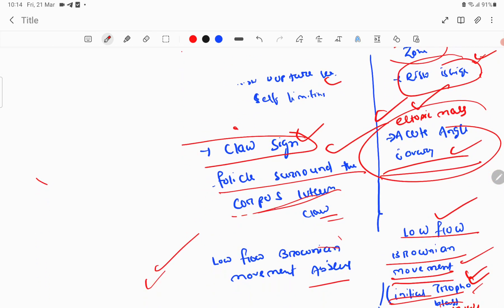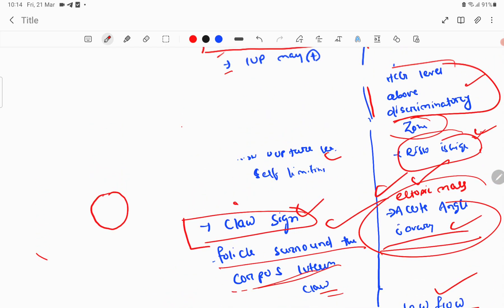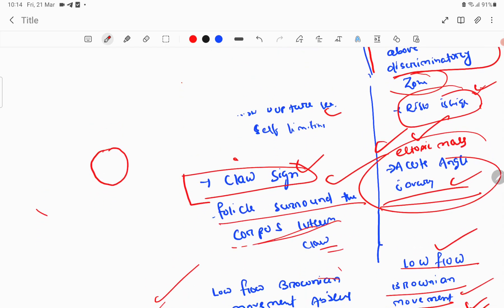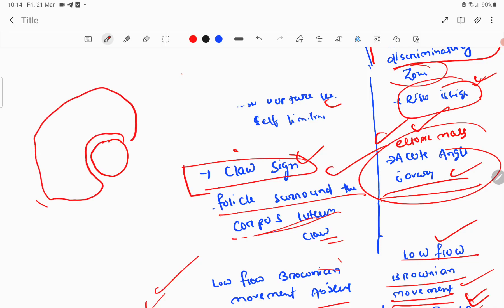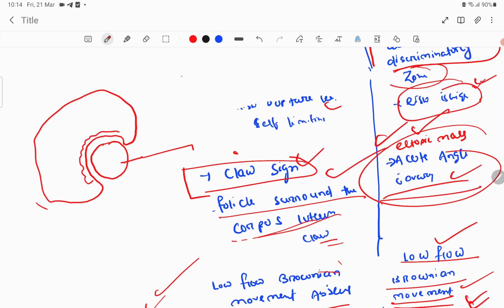The next important sign is the claw sign in the corpus luteum. The claw sign means the ovarian follicles and the stroma of the ovary hold the corpus luteum like a claw. This is a very important sign — the follicles around the corpus luteum surround it like a claw.